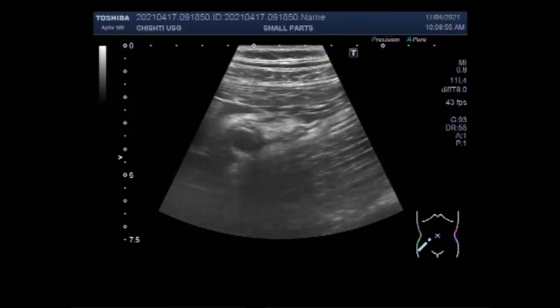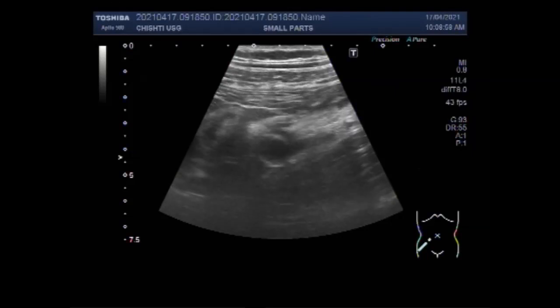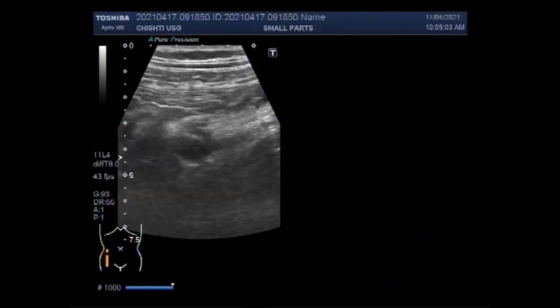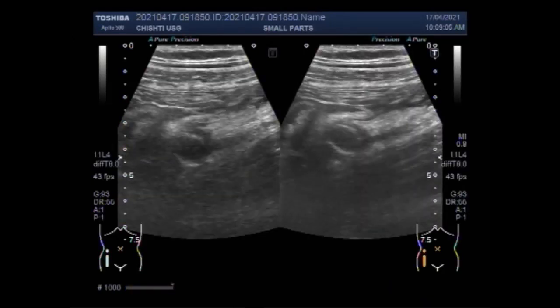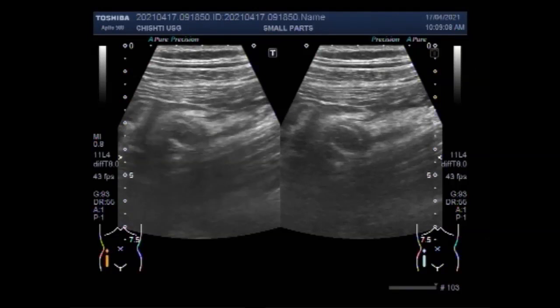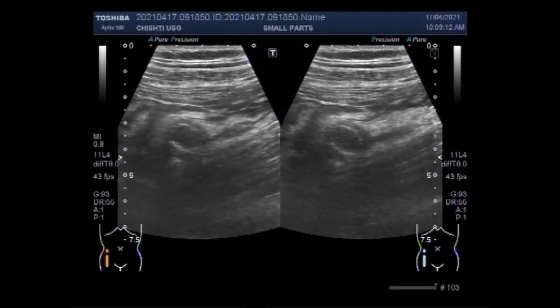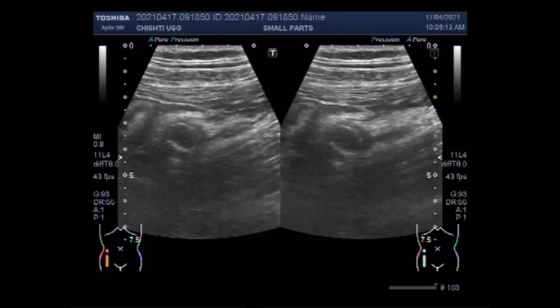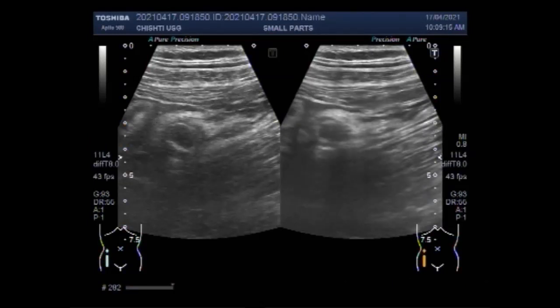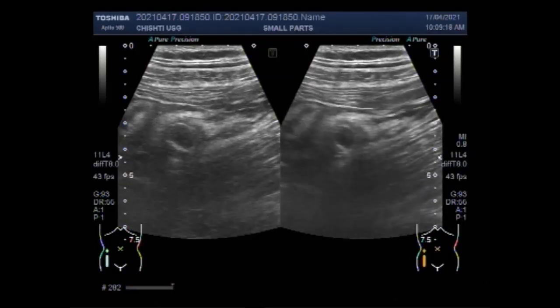First of all, you will have to identify the ascending colon. Then one has to scan inferiorly to localize the cecum, and then one can see the appendix, as you can see in this case. The colon will have the haustra, which will differentiate it from the small bowel. You can see the haustra in the long axis view.